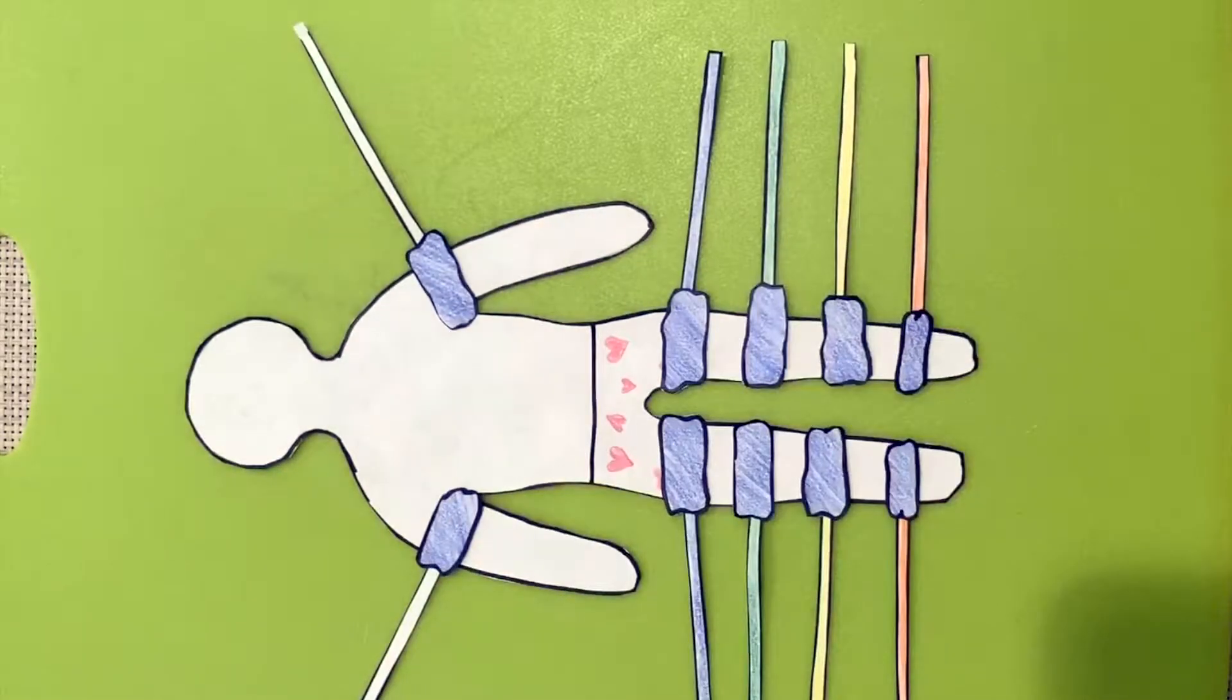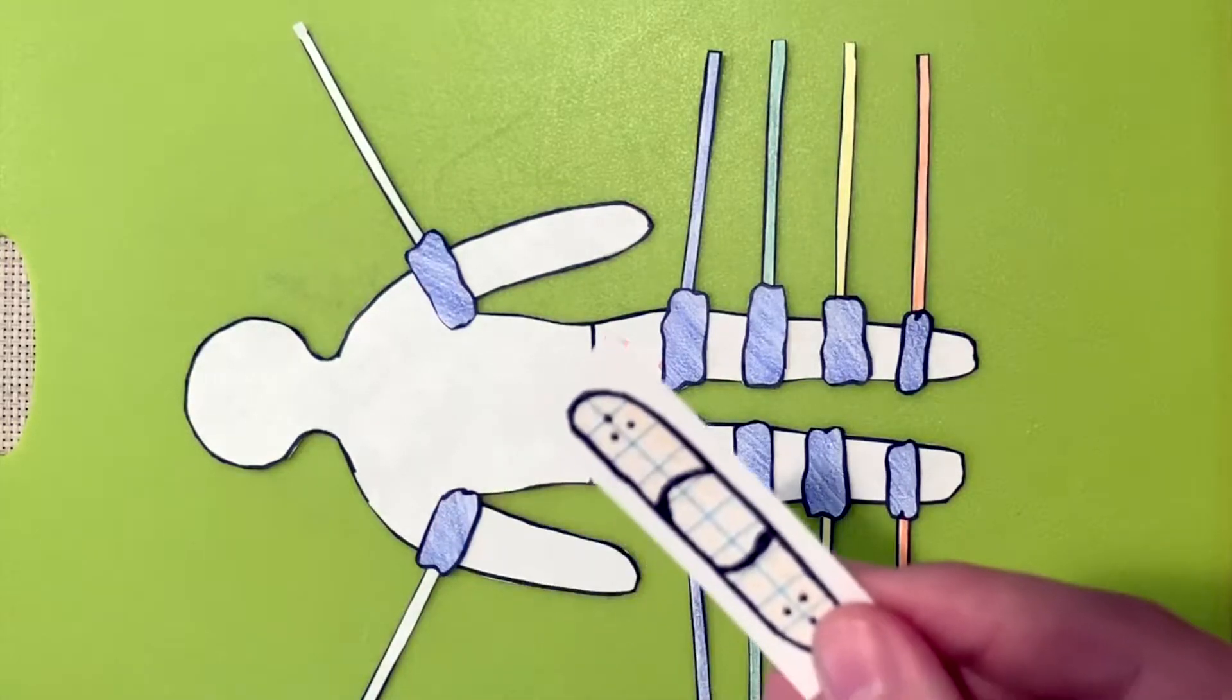After the patient has been rested for a brief time, you will put on the blood pressure cuffs snugly and attach them to the segmental pressure machine. If the patient has had a shunt or graft in either arm, do not take the blood pressures in that arm. Also, if the patient has any open wounds, they should be covered with plastic wrap or a bandage.